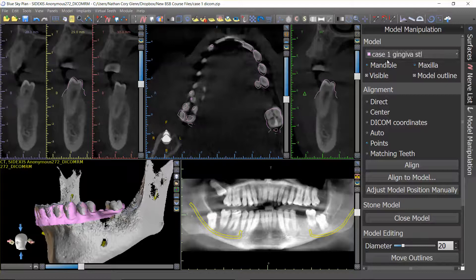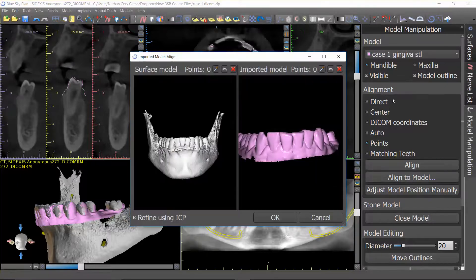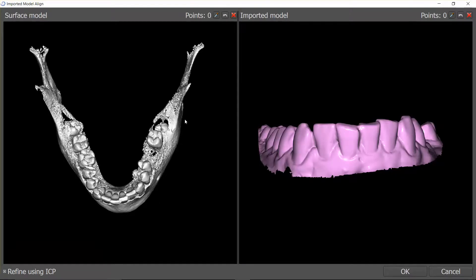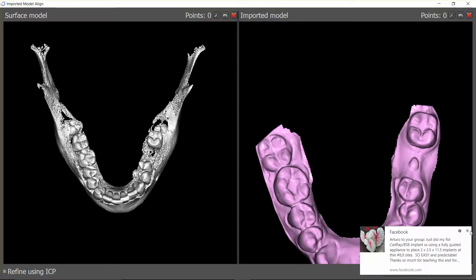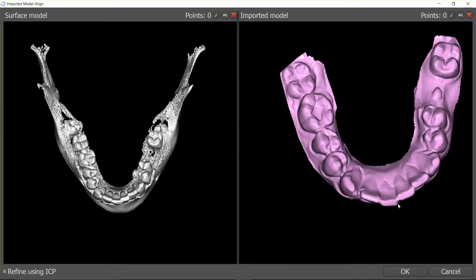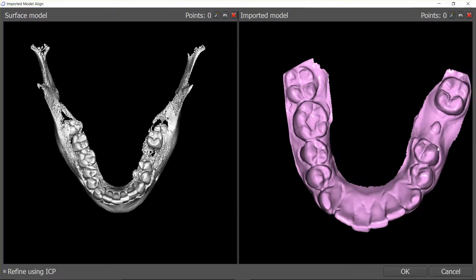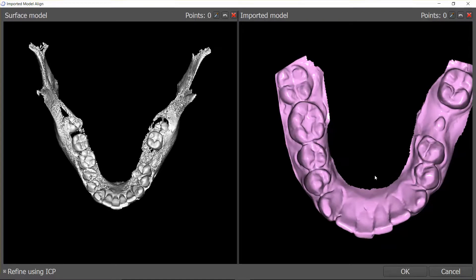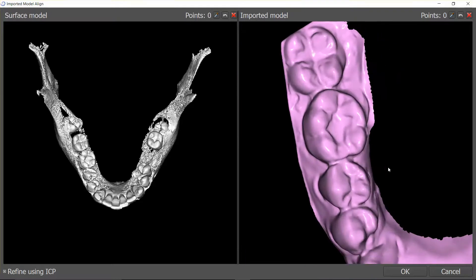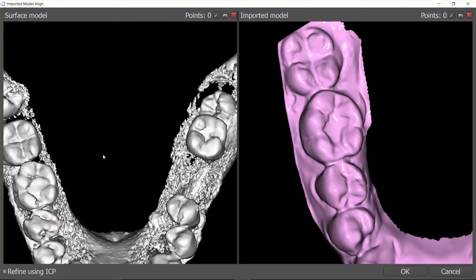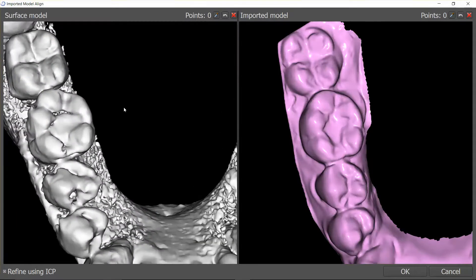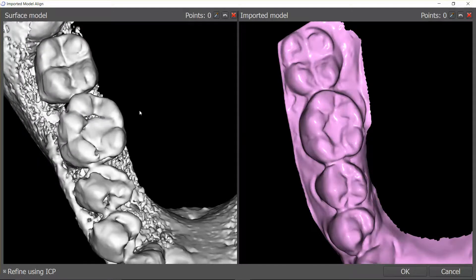We've only got one STL in the case right now — mandible — and then we'll click align. This window will come up and you can see the isolated jaw. If the maxilla were up there you just wouldn't be able to see things correctly. What you want to do is orient these two models in the same position — looking straight down from the occlusal on both models — so you have the same perspective on both. I'm going to zoom in to about four teeth width on screen, because it's important to have the exact same perspective on both models since we want to be extremely specific with our points.